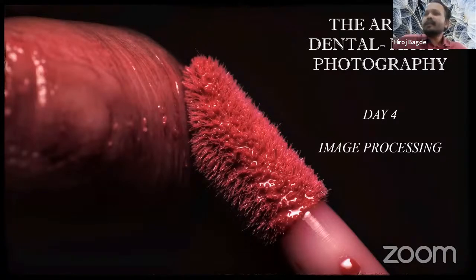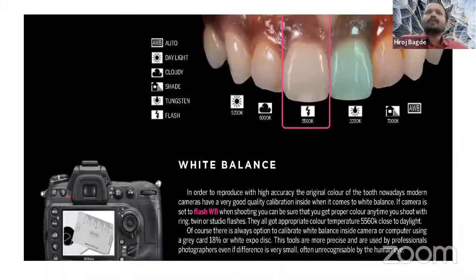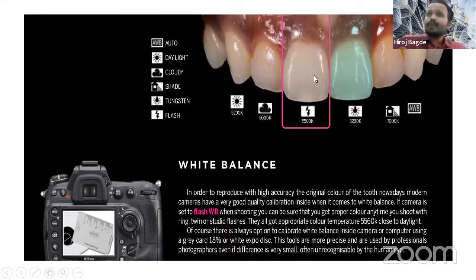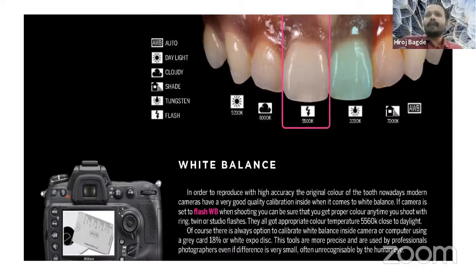Today we'll be dealing with image processing. Why do we need image processing? Just look at this photograph — we have different kinds of shades of the same area that has been clicked. We have color changes, opacity, and luminosity changes. We have filters associated with what kind of images we need. This one is a bit more towards cyan, which is not what we call real. We are going to set white balance at 5600 or 5500 Kelvins as a benchmark or gold standard, so that the image has its own color reproduction every time you click, whether from mobiles or DSLR — both will require changes in white balance.